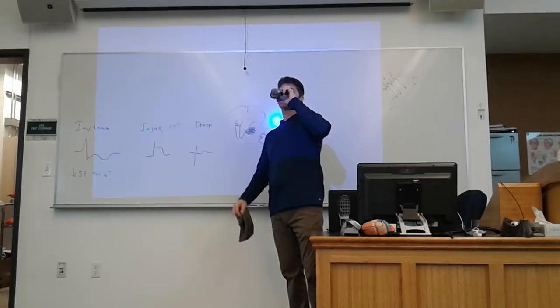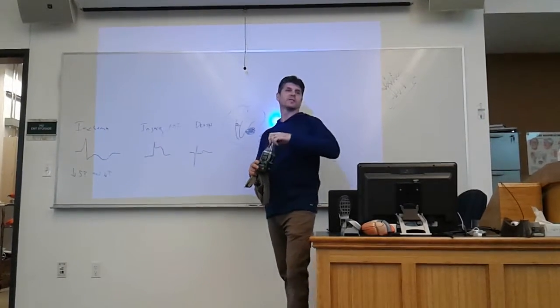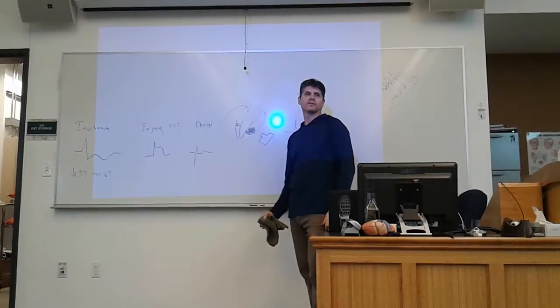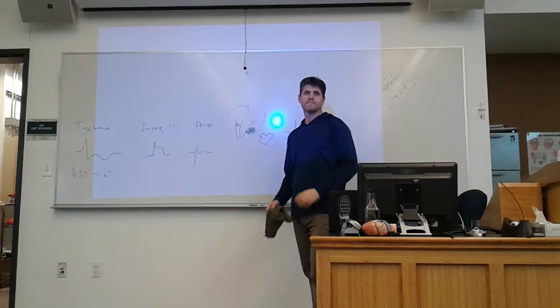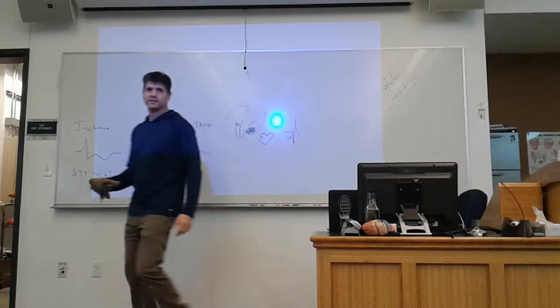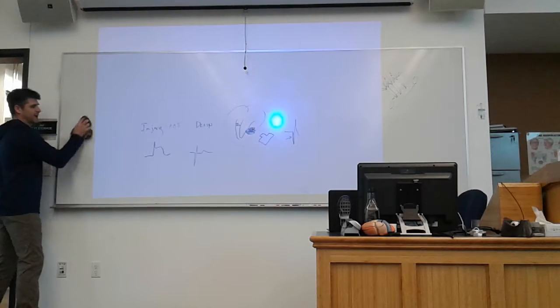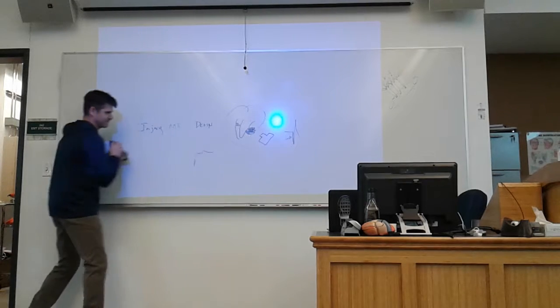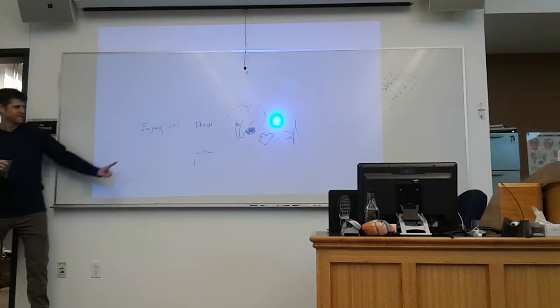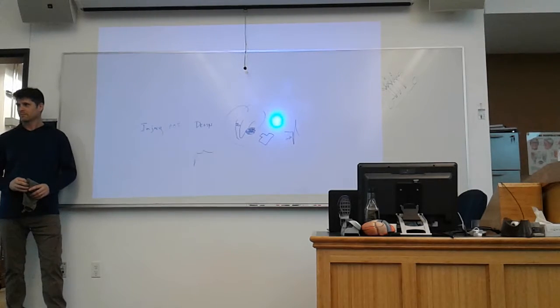You might see diminished lung sounds, you might see swelling, you might see some changes on the EKG that we'll discuss a little bit later. Swelling, you mean pedal edema? Could be, if it's right heart history. You'll see potentially some hypertrophy on the EKG. I'm sorry, that little doodle you did on the injury on that acute MI side, the little T wave is hidden up in the elevation.